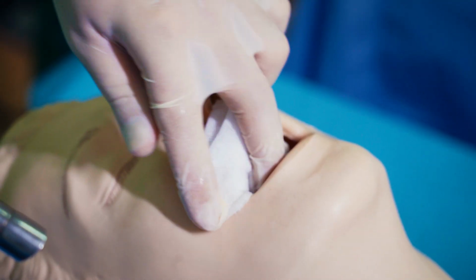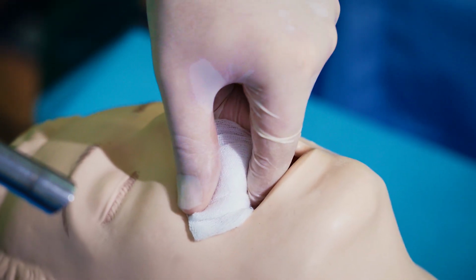A challenge of this technique is to follow an imaginary line from the labial commissure to the thyroid cartilage while advancing the rigid tube and adjusting the position of the larynx with a non-dominant hand by gently pushing the thyroid cartilage. This motion translates to the inner structures around the glottis and helps the practitioner orientate after the tip of the tube reaches the pharynx. Cover the upper molars with rubber teeth protector or cotton swab on the side of the approach.